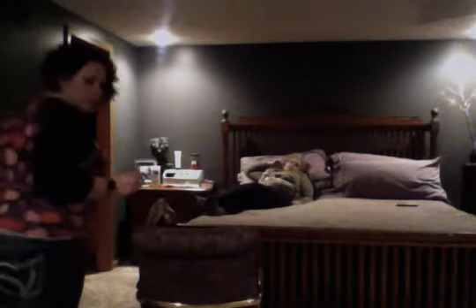Anytime we are working with a patient, we would want to raise the bed to our waist level or thereabouts. Anytime we're in a hospital setting, we have that luxury of being able to raise that bed. So for these purposes, we are going to simulate that this bed has been raised so that I can complete any type of patient care that I would need to.